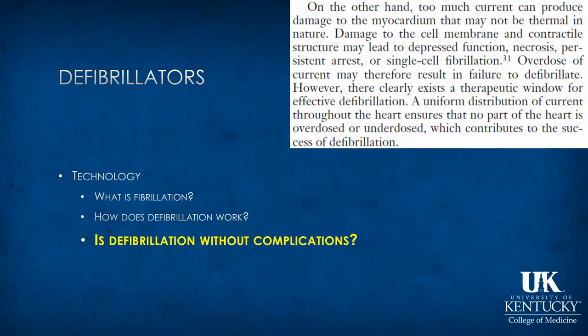It's not as quantitative as you would like, but this is the best one can do with the feedback that one is getting from an emergency defibrillation situation.